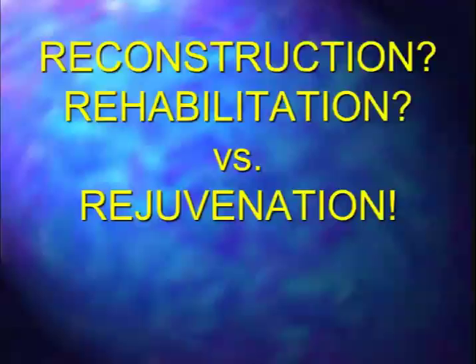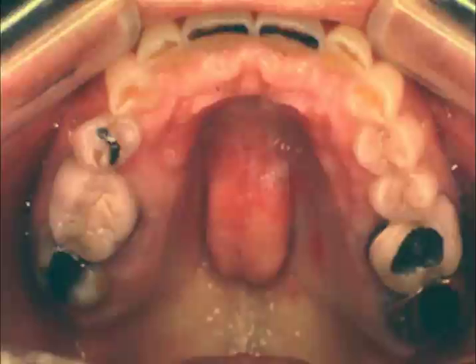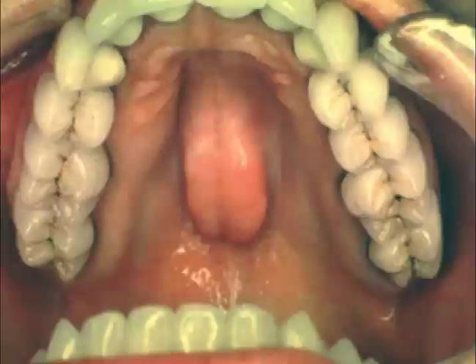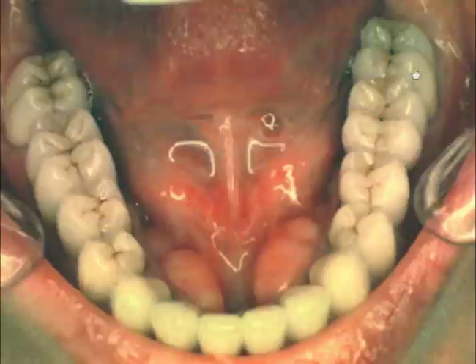Is it reconstruction or rehabilitation? Many times I think we do reconstruct pathology in the teeth, maybe to a lesser degree. Rehabilitation is not a good word either, because nobody wants to go through rehab. I think rejuvenation is one of the most powerful words you can use, because it's not only a renewal of body, but it's also a renewal of spirit. So now we can take a mouth that has a lot of pathology and disease, and here's a couple of teeth that look halfway decent, and restore the individual forms of the teeth with the form of the occluded dentition in harmony with the form of the joint to restore physiology. Again, pathology and disease, restoration back into health.